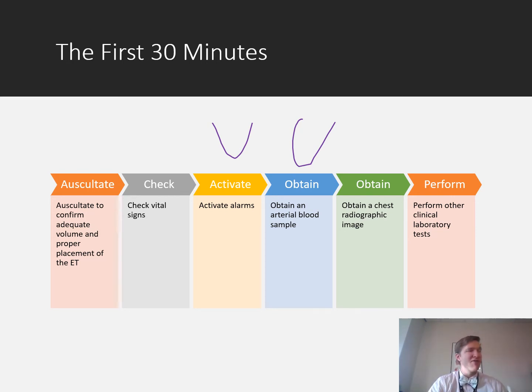You could see that. If you had an end-tidal CO2 in place as well, right, bonus material time, if you had end-tidal CO2 in place and you go in and increase someone's PEEP level and you see the heart rate increase, blood pressure decrease, and end-tidal CO2 decrease, then there's a sign that you just caused venous return to be restricted, and therefore that's why the heart rate's going up.